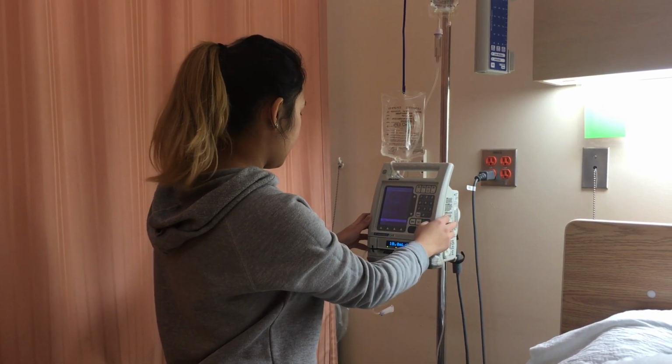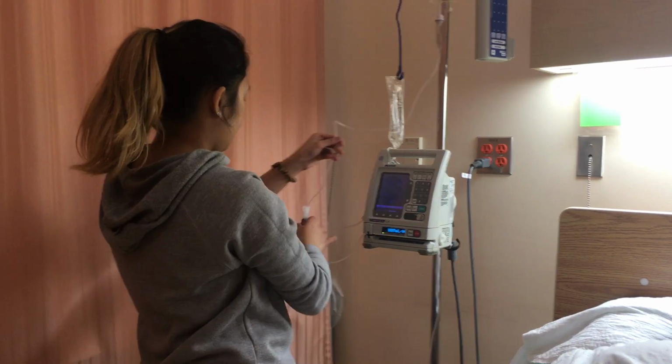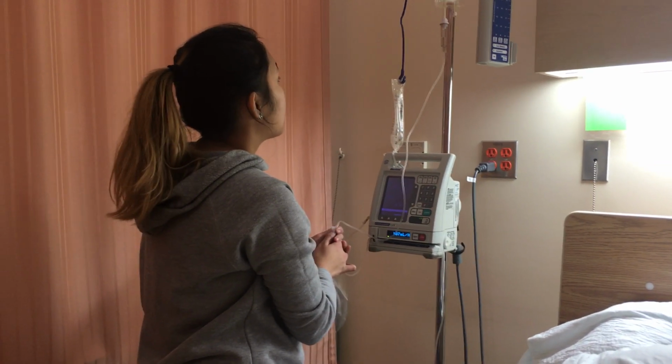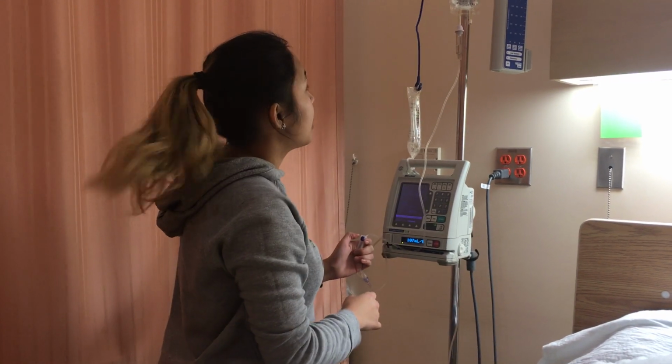I'm going to confirm that. Also, I'm going to make sure that the clamps are open. And I'm going to observe for 3 drops.